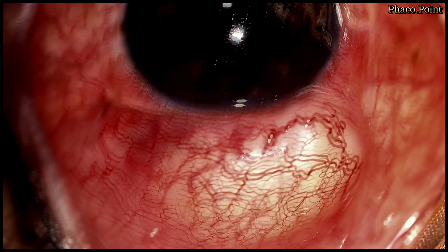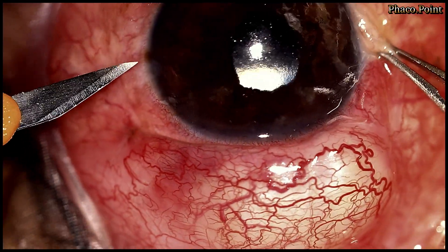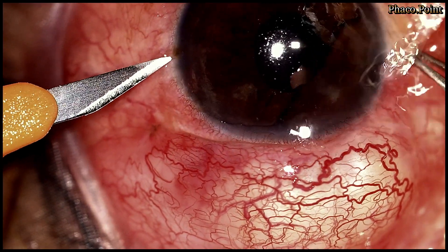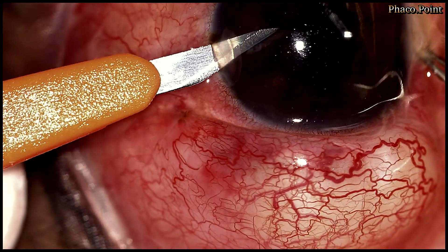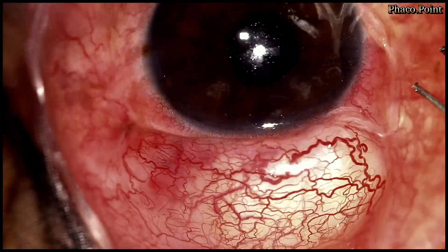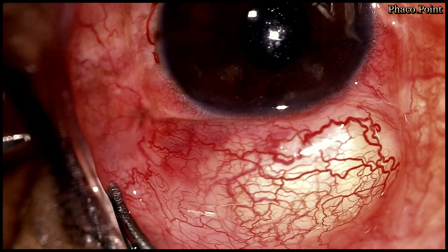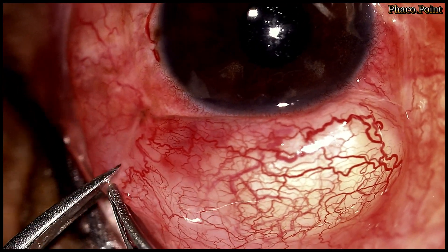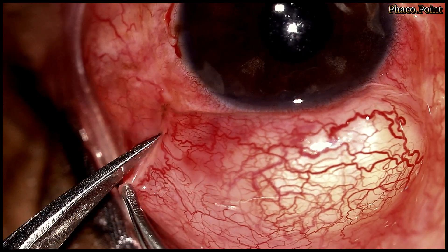Let's move to watching the surgery. The first step that I would always do is perform a paracentesis, because I want to gain access to the anterior chamber due to the possibility of its shallowing at any time.